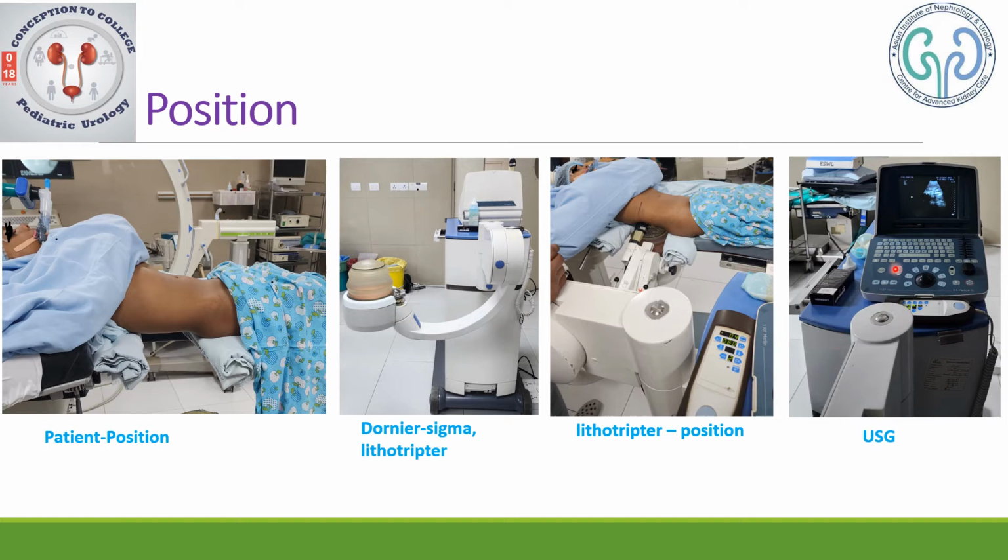In the ultrasound, you could also see a post-acoustic shadow before the procedure is begun, though the calculi is not clearly visible in this zoomed out view.